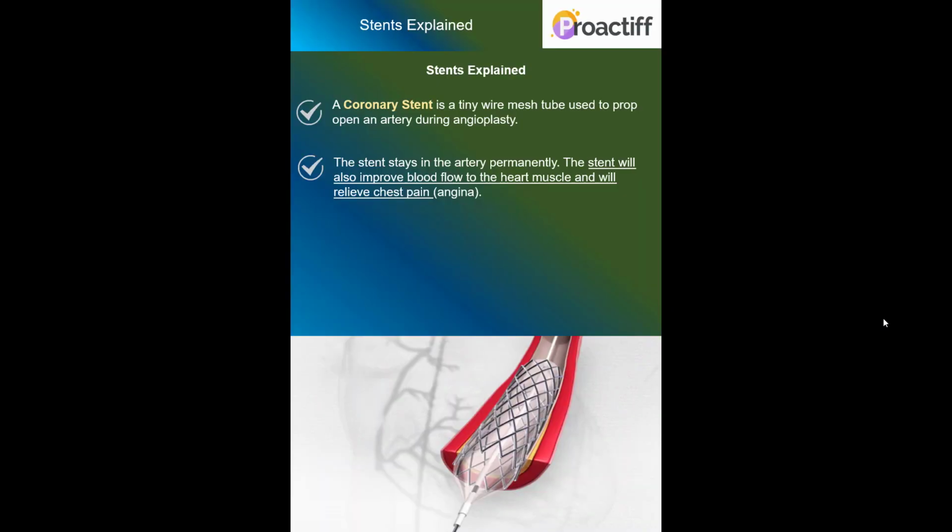What is a stent? A stent, as it's often called, is a coronary stent, a tiny wire mesh as shown in the picture that is essentially tube-like and inserted into the arteries during the procedure called angioplasty. The stents stay in the artery permanently.